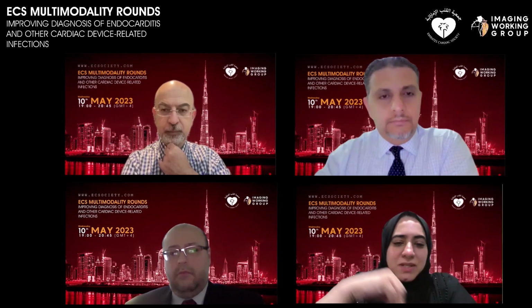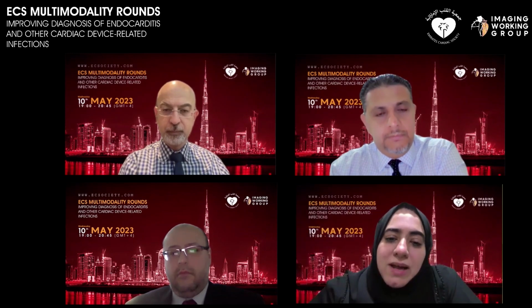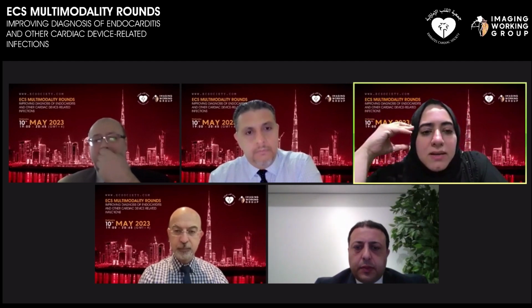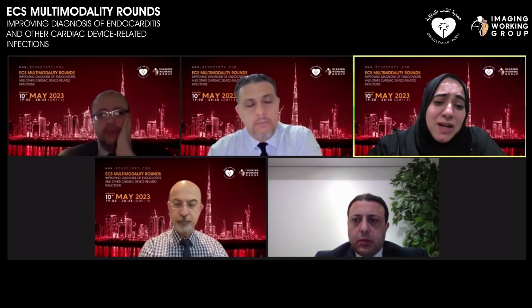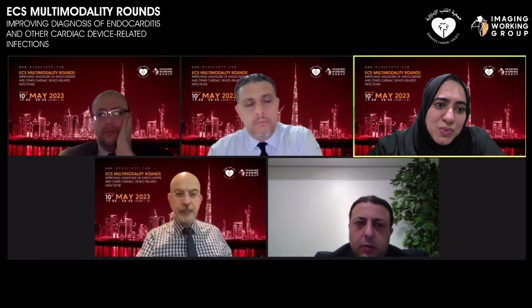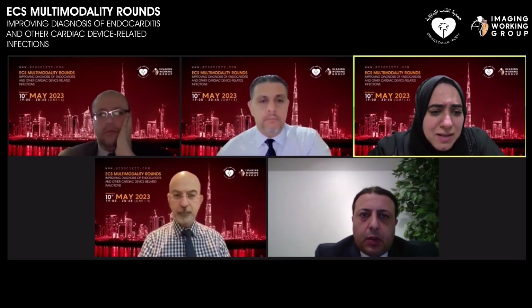So I think this was mentioned clearly in Dr. Khalil's presentation. So if you still have the suspicion and you did not get the diagnosis from the initial images, then it's reasonable to repeat it after 5 days to a week. Of course, so what's your suspicion, right? So this is the question. How are you going to suspect it? So generally, if you have someone with a prosthetic valve and you have on and off fever, whether or not you have bacteremia, that's sometimes difficult to achieve, especially with a lot of use of off-label antibiotics in the community. So sometimes you don't have bacteremia, but you have the symptoms.